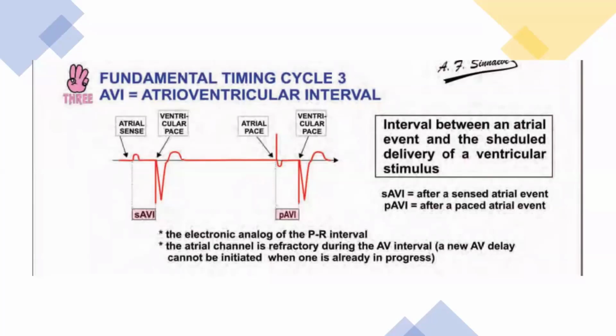But when I implant a dual chamber pacemaker in a patient with complete heart block, it's like I implanted a new AV node for this patient. I regained the connection between the atrium and the ventricle. And this connection is done through the AV delay, the atrioventricular interval.